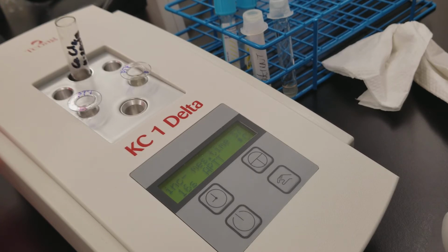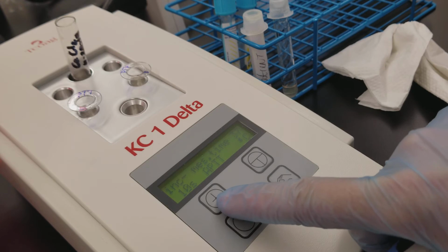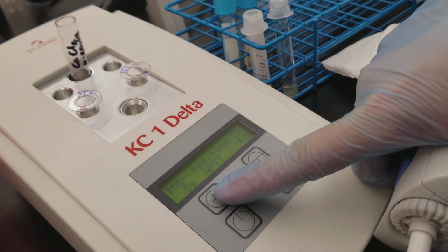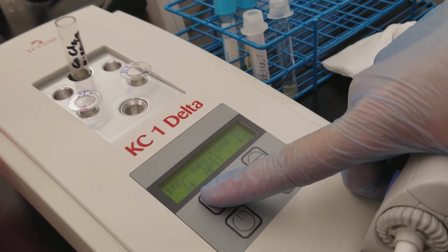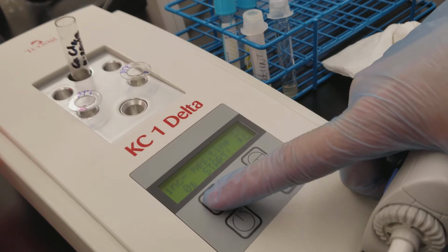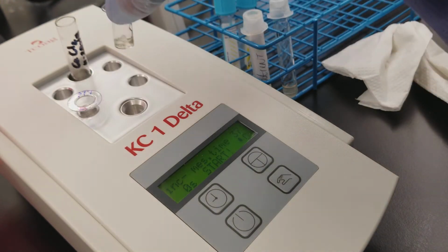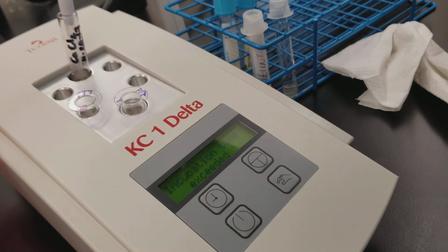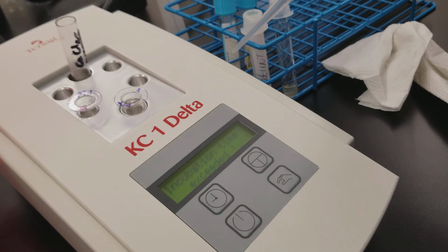So when we get to zero, within 4 seconds of it hitting zero, you're going to need to hit this clock facing button right here. Okay, let it hit zero. Zero. Okay, we hit it. Now we can move this here. All right, I can take my calcium chloride out here. Same amount, it's 100 microliters.